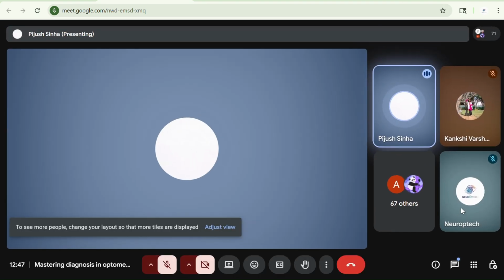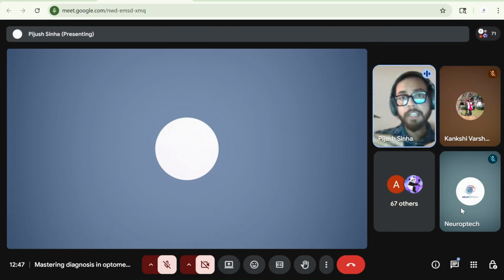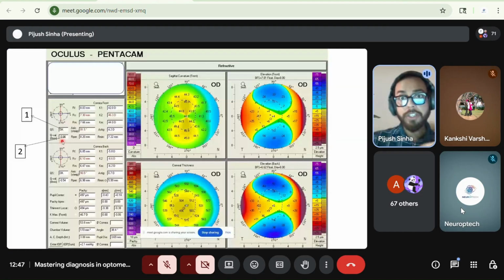This value should be in between 0 to more than -1. In case of corneal ectasia, it is showing the hyperprolate condition. But whenever a patient comes to us for LASIK, we make the prolate cornea oblate, means we are making the center of the cornea flatter and the periphery steeper. So if it is in plus sign, it is showing oblate cornea. If it is in minus sign, it is showing the prolate cornea. It should not go beyond -1.